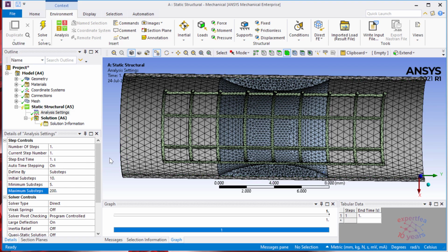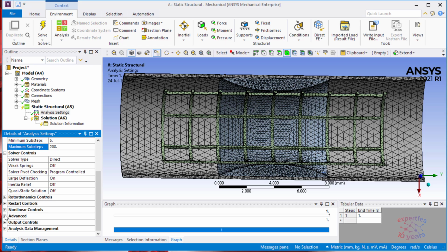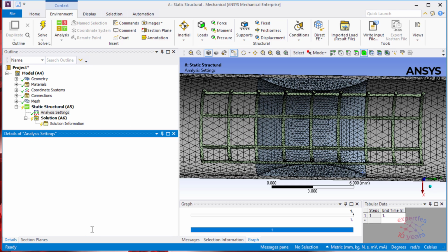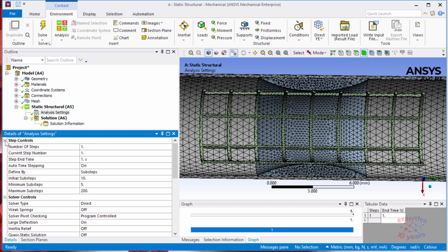But this analysis does not take place in time, it's not dynamic, so it's purely static. This is why we are using substeps. What we want more is here on the output controls. Let's make everything yes here, because we will be interested in getting also other output. Let's minimize here.